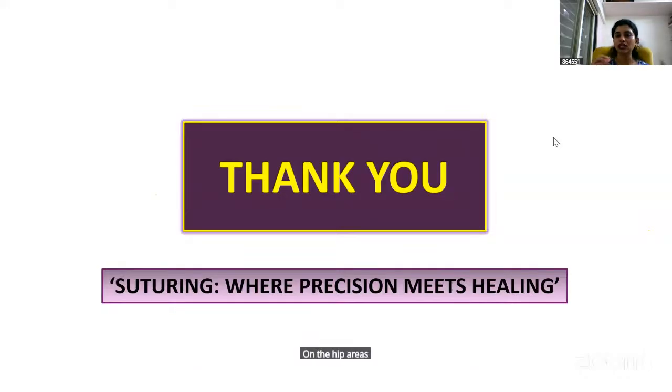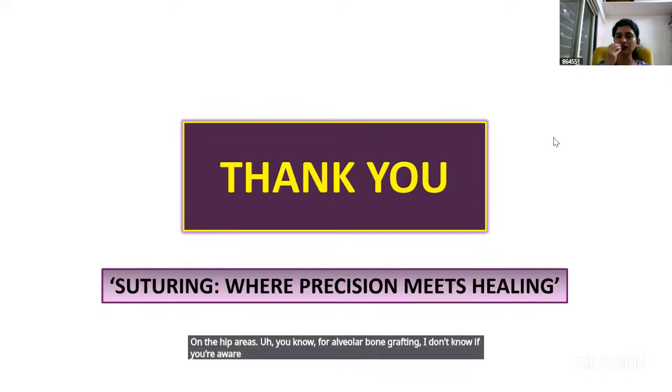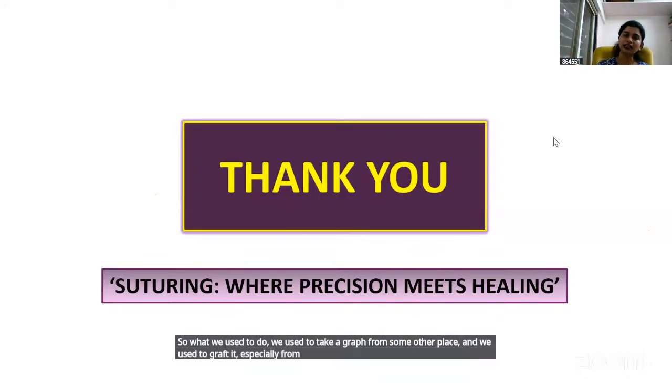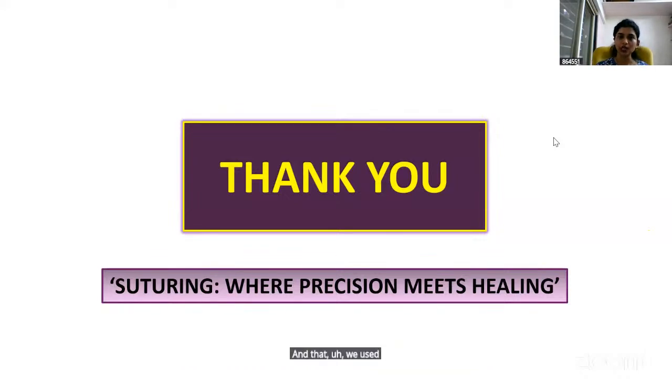For alveolar bone grafting, I don't know if you're aware of this term, where there is some deficit of the alveolar bone. What we used to do is take a graft from some other place, especially the hip area, and graft it intraorally. That area, the donor site, we used to close with the proline suture.